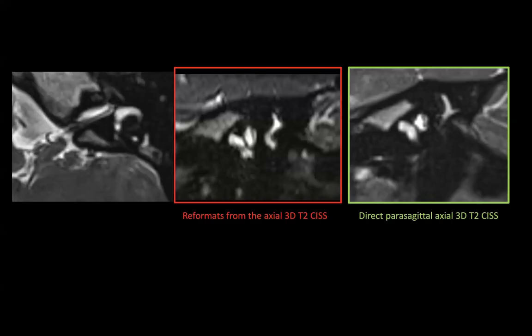And this is a note of color. It's a concept that I learned thanks to Professor Andrea Rossi, who is passionate about spinal dysraphism. He always teaches about spinal dysraphism. And once in a lecture, he said, if you have a doubt, you need to run a CISS in 2 directions, axial and sagittal, to really understand where these abnormal fibers are going into the area of defect.